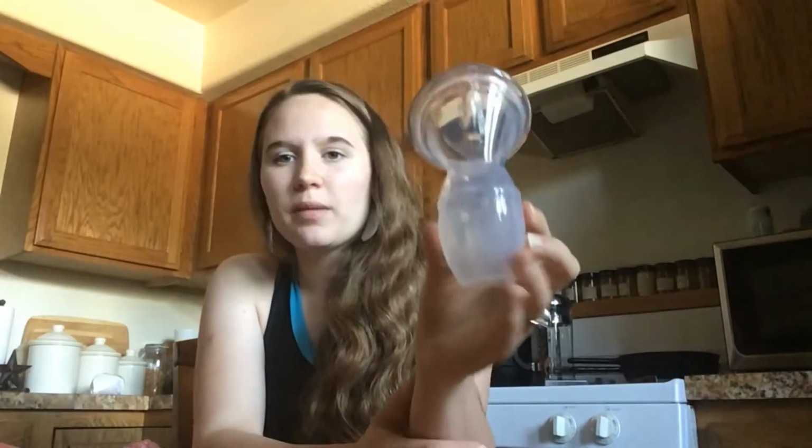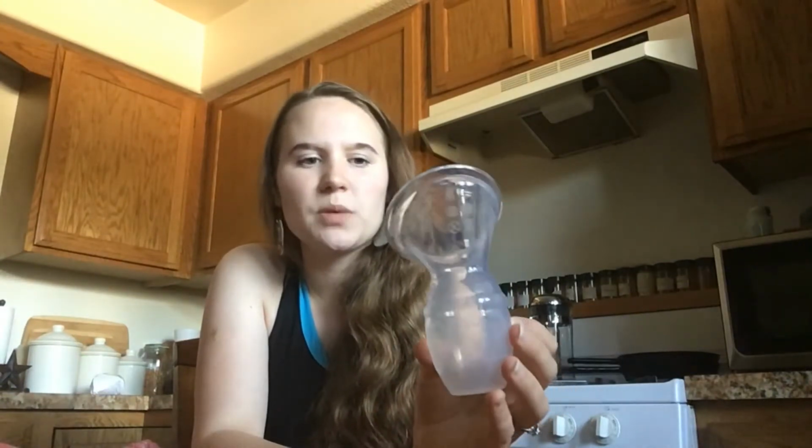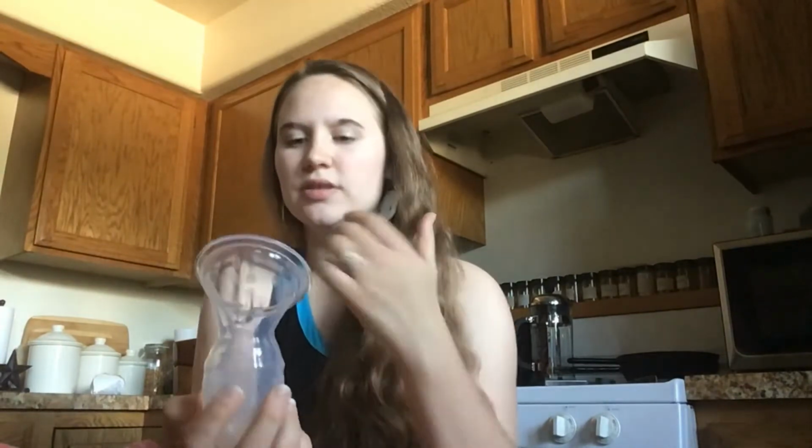Anyway, with that said, we're going to go ahead and move on to something I just bought recently, and this is a Haka breast pump. I also have a regular breast pump, which I'll talk about later, but this is awesome. It's 100% silicone, and it is a hand pump. It's hand expression kind of thing. And so essentially how you use it is you push this down, you put it over your breast, and then you let it go, and it suctions to your breast. Sorry if that's a little TMI.